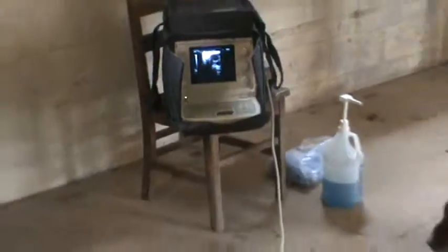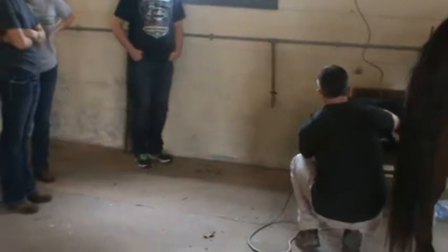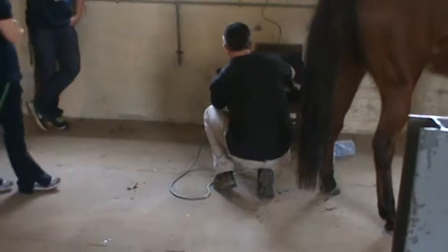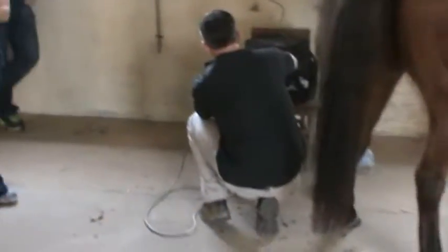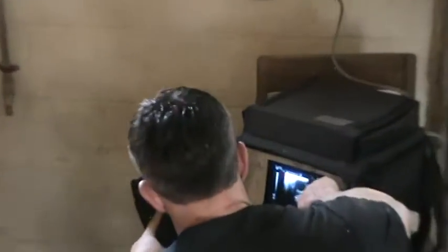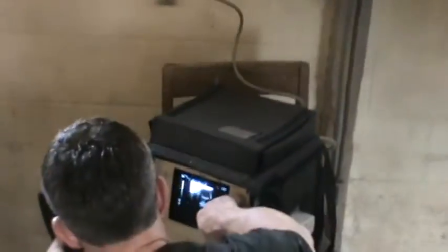Alright. If you all want to slowly come up here, just real quietly. So this is her ovary. I didn't get to find her left, I'll go back in the field just a second. But this is about tennis ball size. She has two or three follicles. Here's a little tiny one that we would call a primary follicle. This is a secondary follicle, and this is what we call an intermediate follicle or almost a tertiary follicle.